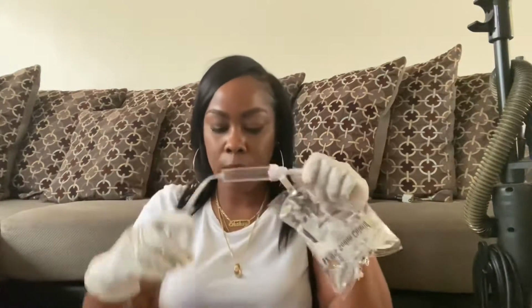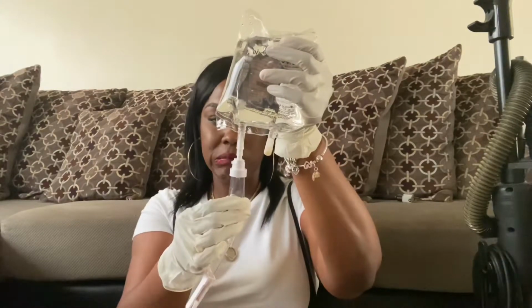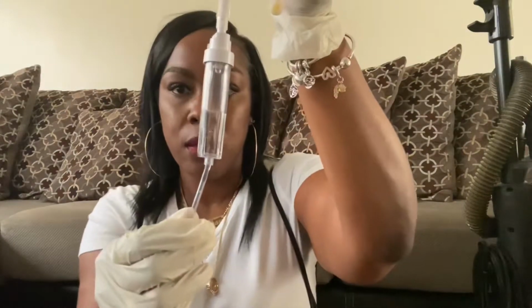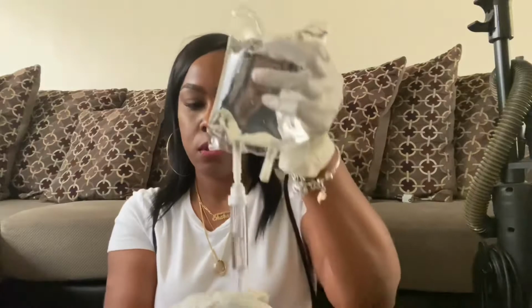Got it. Okay. Also, whenever you're priming anything, I want to make sure that the clamp is locked, because I don't want the fluid to just be going all the way down. So what I'm going to do is squeeze this a little bit, just to put about two-thirds, that's about enough, into the drip chamber. After I do that, I'm going to hang it up.